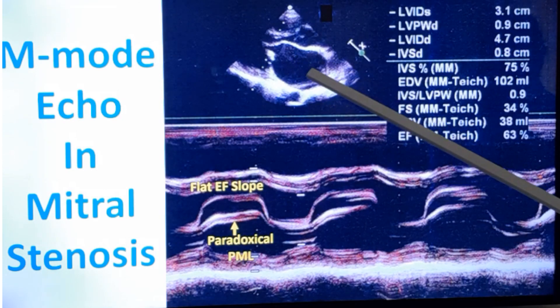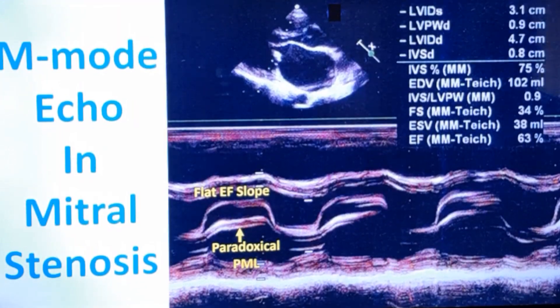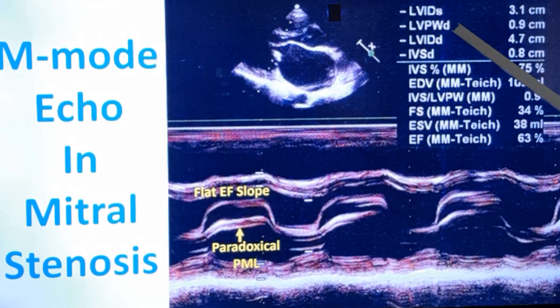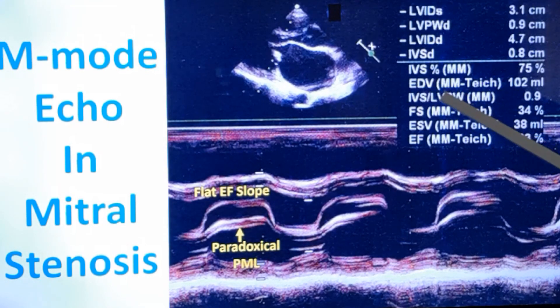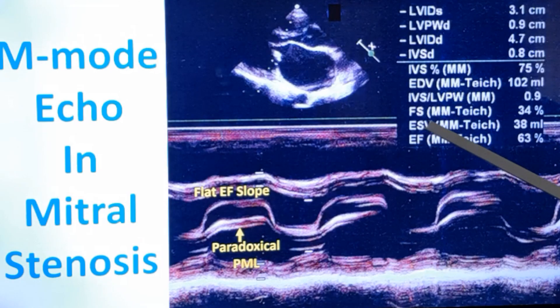The left atrial dilatation is secondary to mitral stenosis. The measurements of the left ventricle are also shown here: left ventricular internal diameter systolic, left ventricular posterior wall diastolic, left ventricular internal diameter diastolic, interventricular septum diastolic, end-diastolic volume, ratio between interventricular septum and posterior wall, fractional shortening, systolic volume, and ejection fraction.